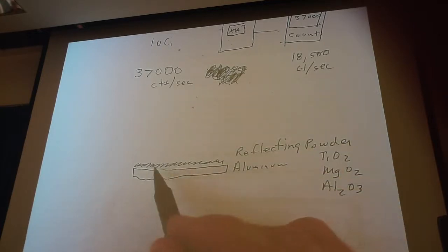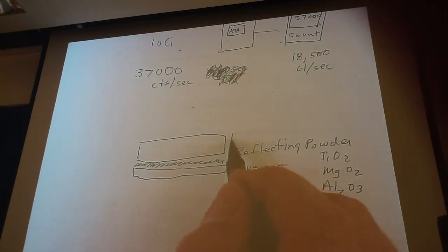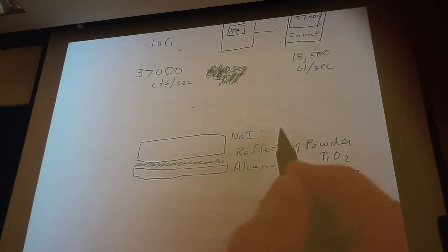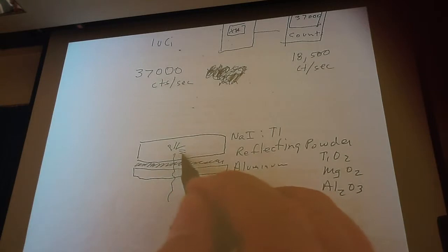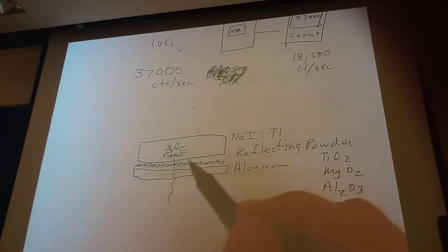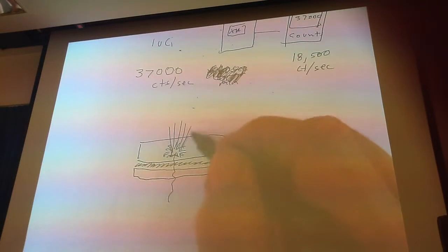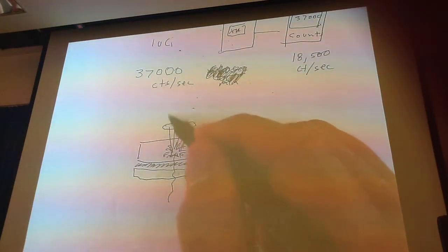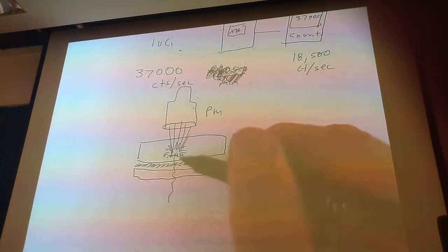So if I put this layer on here, and then I put a crystal on top of that, so this is my sodium iodide crystal, doped with thallium. When the radiation comes in, remember that light is produced and goes 360 degrees. I don't want to lose that light. So I put reflecting powder here, so any light that's reflected towards the outside of the gamma camera is now going to go up and be observed by our photomultiplier tube. Does that make sense?